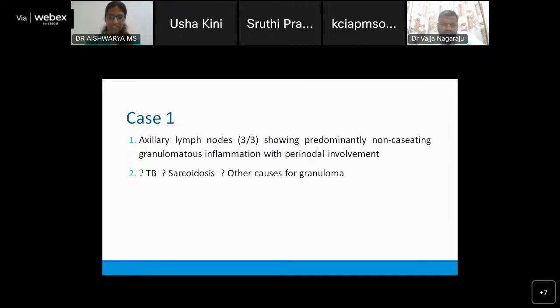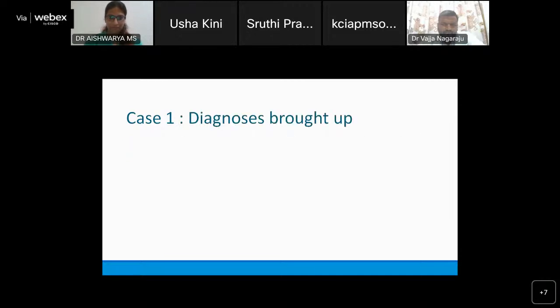Yes, Aishwarya. Now, I'll show you the diagnoses which have been brought up by the others. Shall we try? Sarcoidosis, let's see whether it is sarcoidosis. So what would you say? Can this be sarcoid? But you gave me a whole lot of differentials. Do you favor sarcoid or not? Yes, ma'am. I would favor sarcoidosis more than anything else because of the Schaumann bodies.